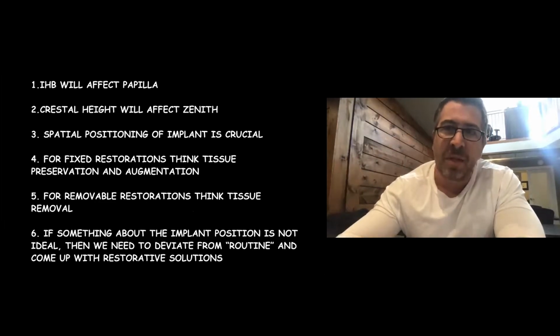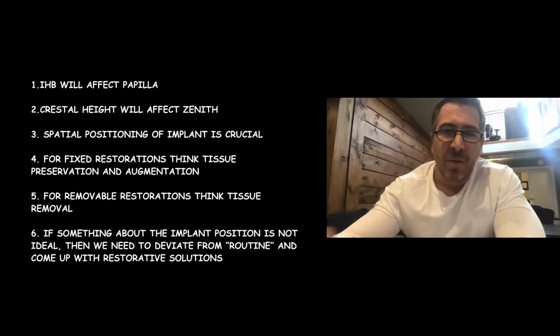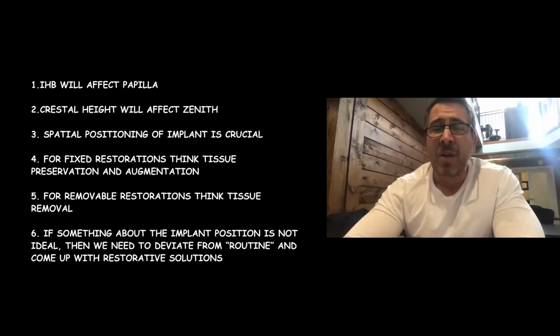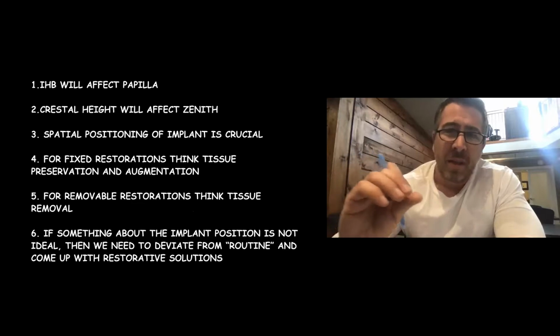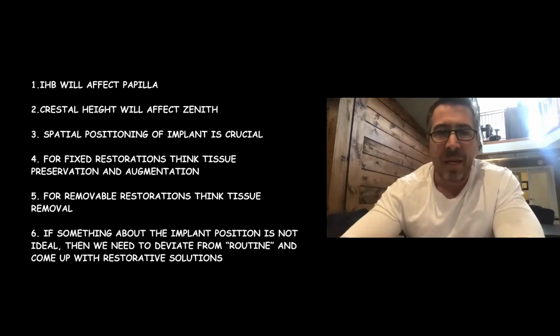For dentures, as I said in the first slide, the patient's committed to pink prosthetics. They know they're going to have acrylic. You're going to think about subtracting tissue so that you've got the right spatial dimensions and clearances, interarch clearances. So you've got room for the denture tooth, the flange, the bar, the conus abutment, whatever it is you're doing, you need the space.